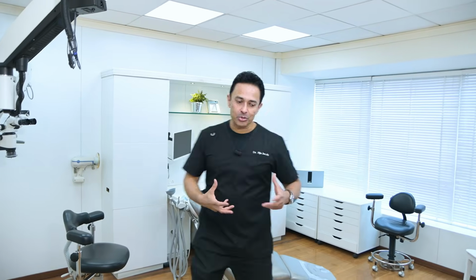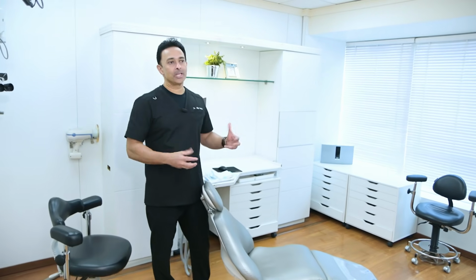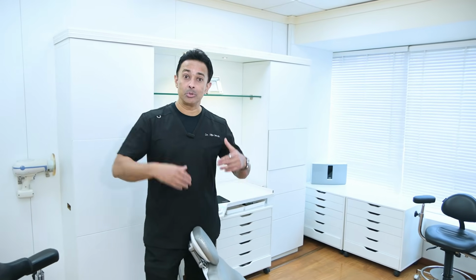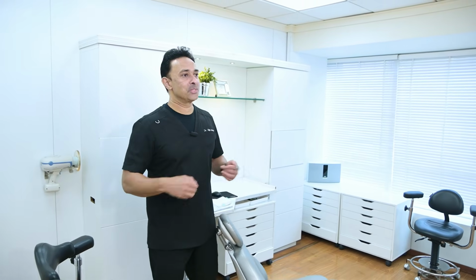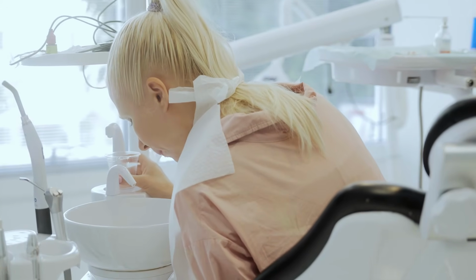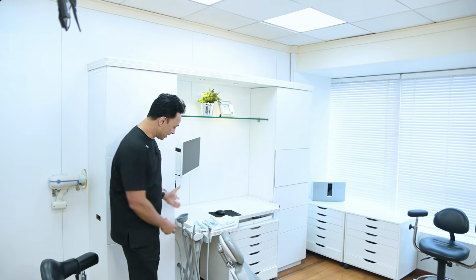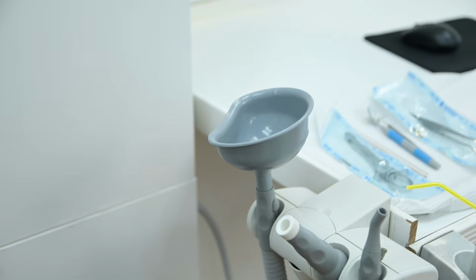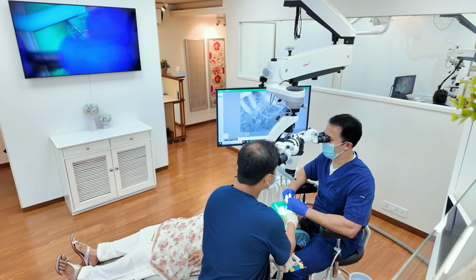The third thing, if you see the dental chair, it doesn't have a spittoon. So we don't see the need for a spittoon. Most people just accept that you need a spittoon, otherwise you can't do dentistry. In reality, you don't need a spittoon because why should anyone keep spitting? But if at all someone badly needs to, then we move the spittoon to a separate area, a small kind of attachment, which is away from the chair. So that's the third reason why the whole operatory looks much more open.